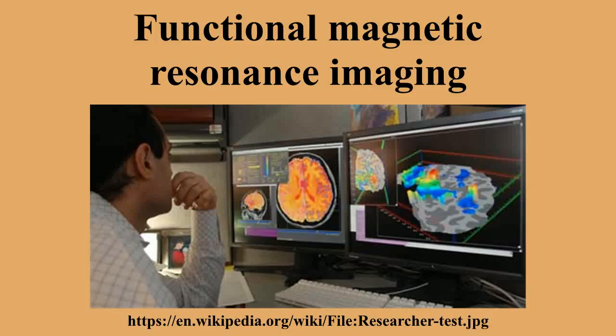Nearby regions such as the pulvinar nucleus were not stimulated for this task, indicating millimeter resolution for the spatial extent of the BOLD response, at least in thalamic nuclei. In the rat brain, single whisker touch has been shown to elicit BOLD signals from the somatosensory cortex. However, the BOLD signal cannot separate feedback and feed-forward active networks in a region. The slowness of the vascular response means the final signal is the summed version of the whole region's network.